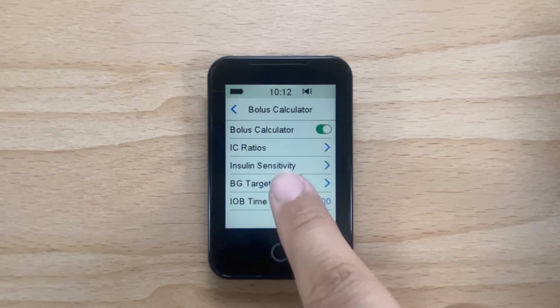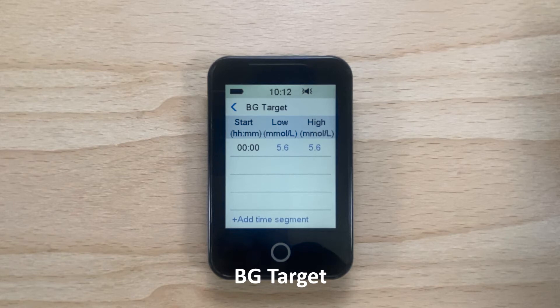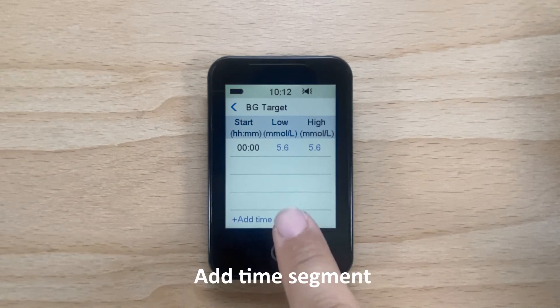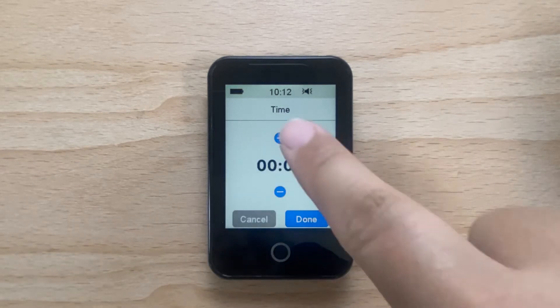Now you can set the blood glucose targets for your pump by tapping on BG Target. You can add up to 8 different time segments for the day depending on your need for blood glucose targets at different times. Tap Add Time Segment to add a new time segment.